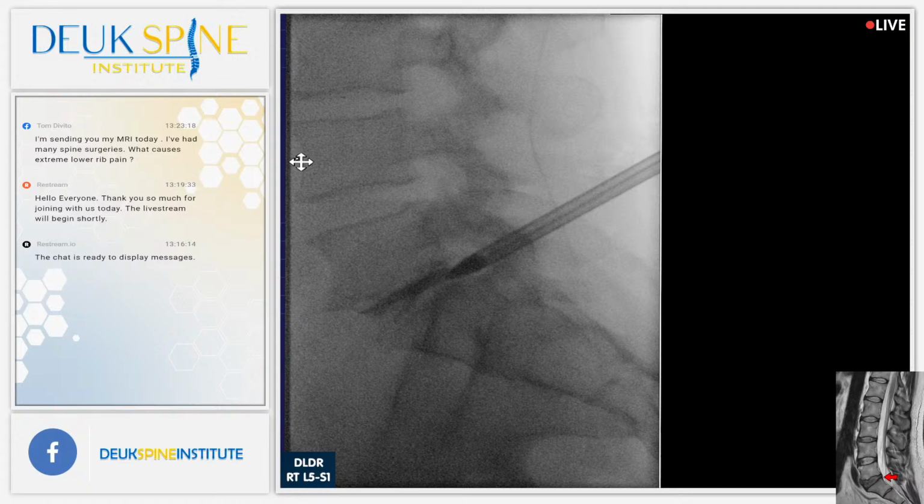That's the part where we are right now. We are right there, and that's why he's responding, because he feels it. That's the painful part of the disc injury. So what we're going to do today is go in, find that tear, use a laser to clean it up, get rid of the herniation stuck in there, clean up the edges of the tear so that it'll heal properly. And the pain from the disc will be gone once we do that. We're also going to fix his facet joints.